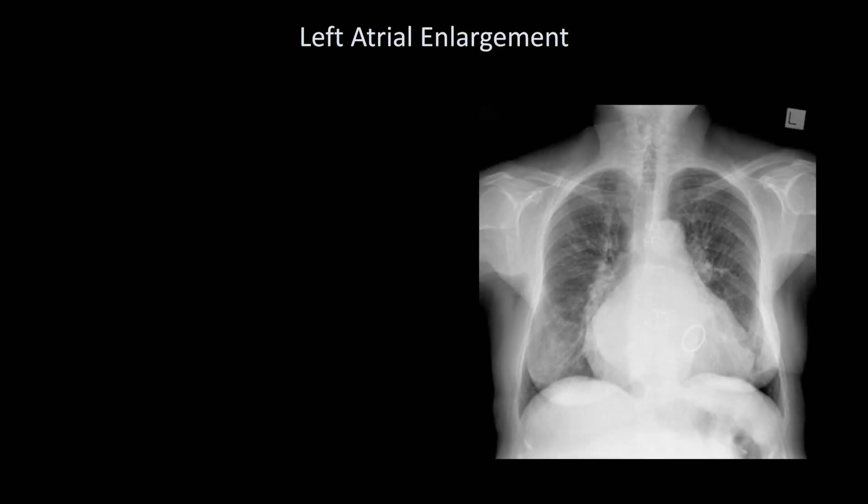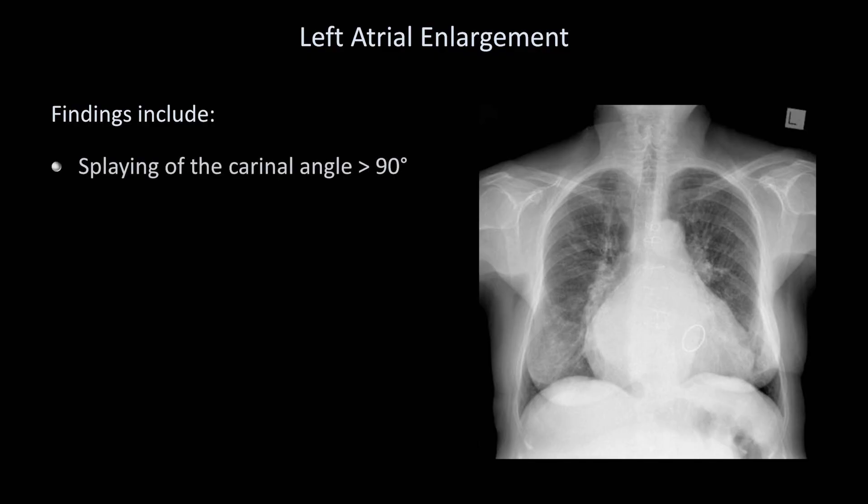While the finding of cardiomegaly concerns the heart as a whole, there are two cardiac chambers that can be identified as being enlarged on x-ray individually. The first is the left atrium. As discussed in the last lesson, one finding of left atrial enlargement is splaying of the carinal angle to a value greater than 90 degrees.